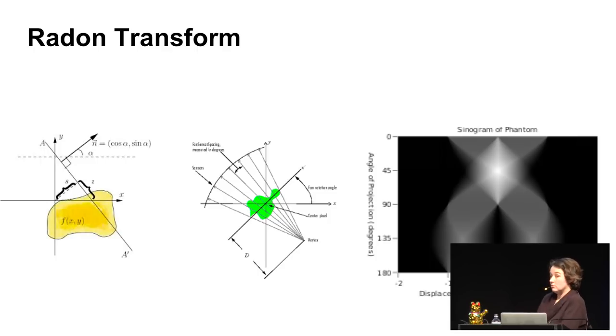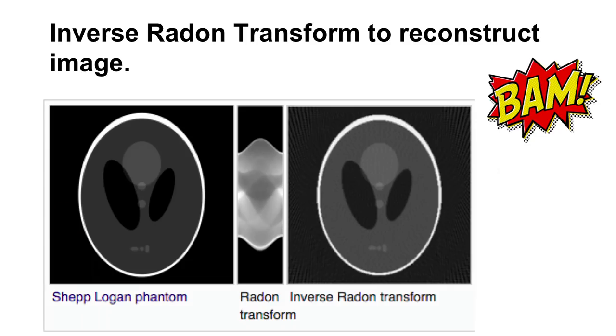This is the Radon transform. That's what it's called. And you basically just send lots of current through these different, slightly different angles, and you build up something called a sinogram, which is over there. And then you invert it to get the image back. I used OpenCV, which is a really common image processing library, to do this. You can just do it with a regular image yourself and try it out. But what I did is exactly the same as what you'll do with a regular image, except I use current to be the input data.